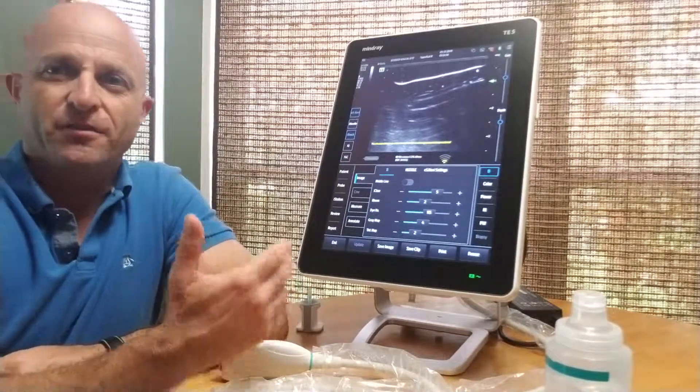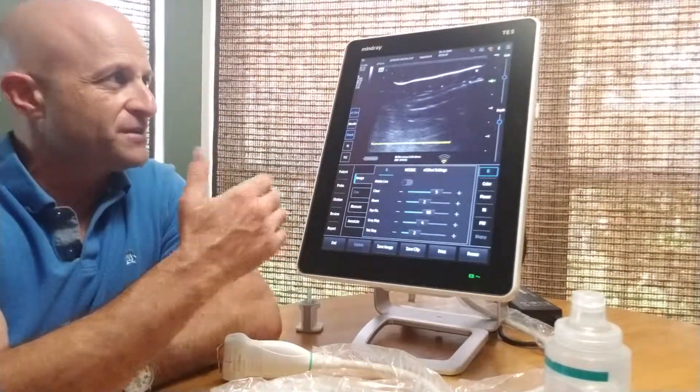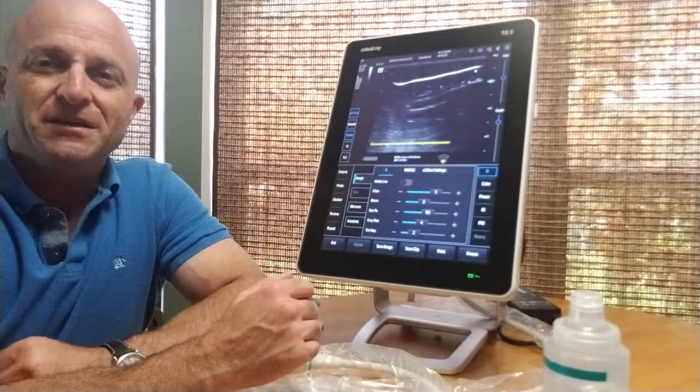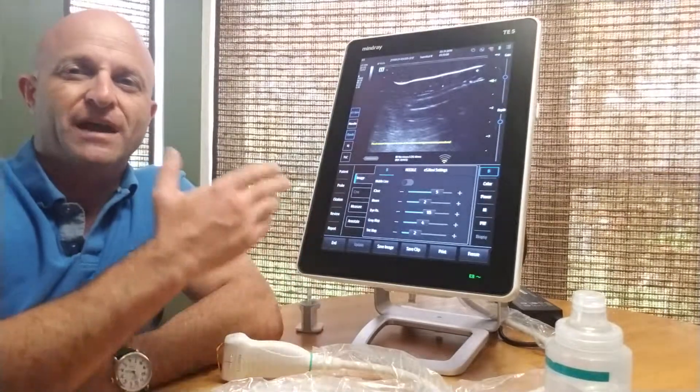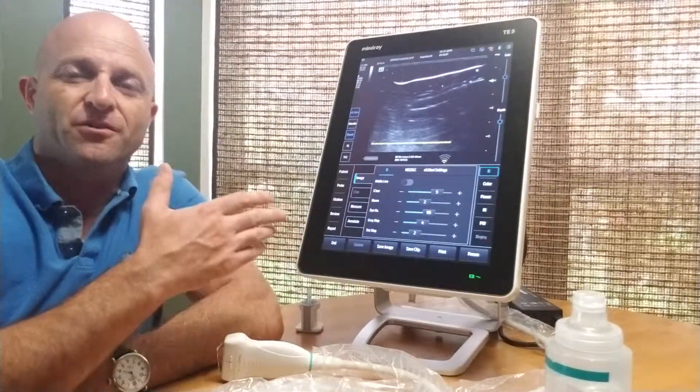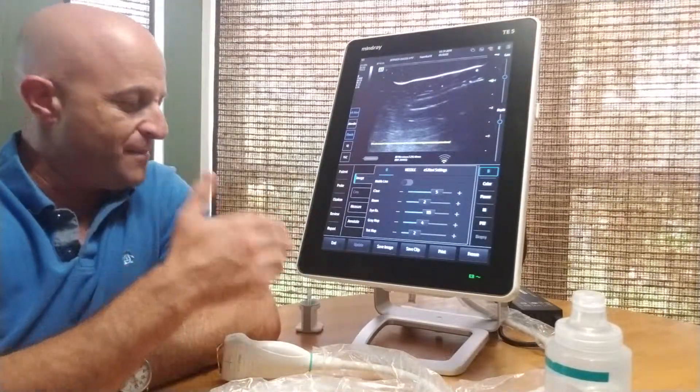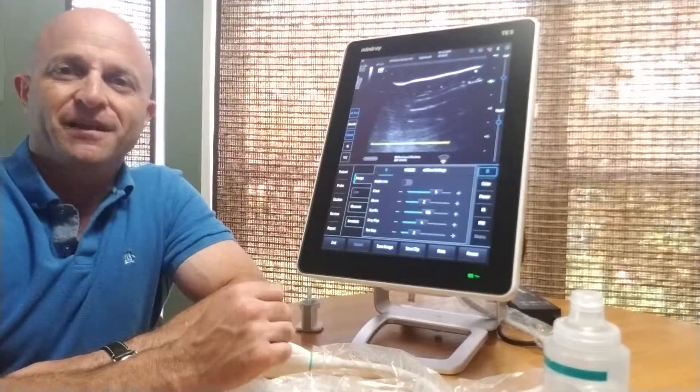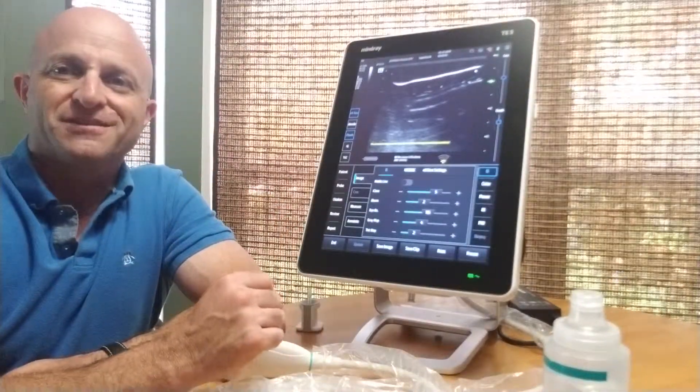This is Jeff with Complete Medical, and this is the Mindray TE5 ultrasound with e-spatial navi — the magnetic needle guidance system.